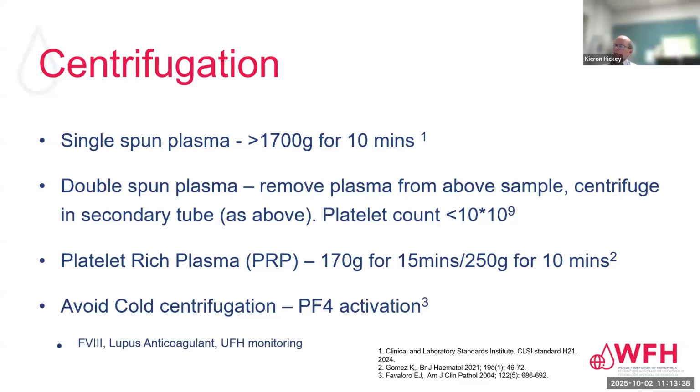And when you are centrifuging samples, avoid cold centrifugation because that can lead to platelet factor 4 activation, which has been shown to interfere with things like factor 8 measurement, lupus anticoagulant detection, and unfractionated heparin monitoring. Next slide, please.